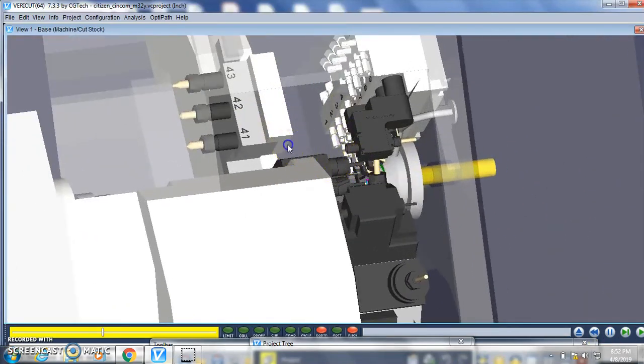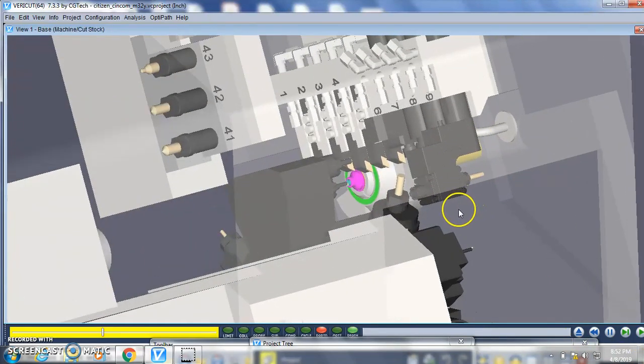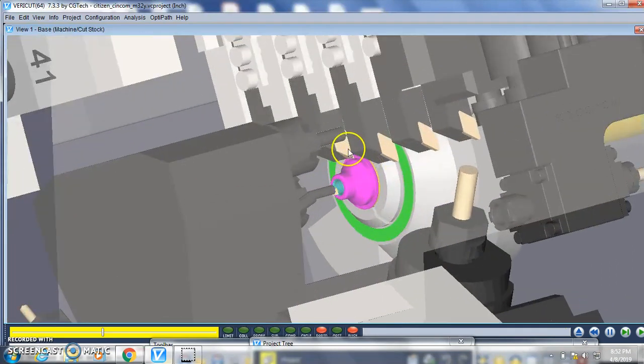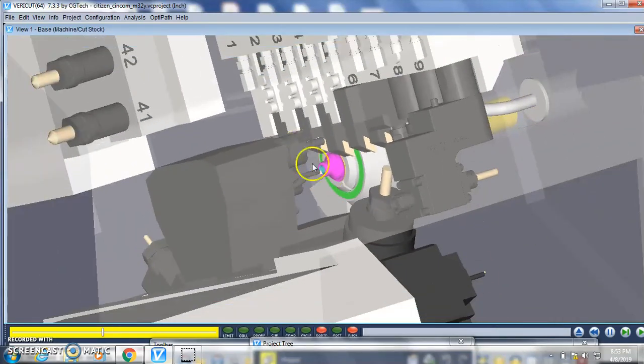Pause it. Let's look at how they work simultaneously. When the turret is working, the gang will wait, or if the OD tool on the gang is turning, you can do the ID work, or if you want to do synchronized turning, you can do that too.